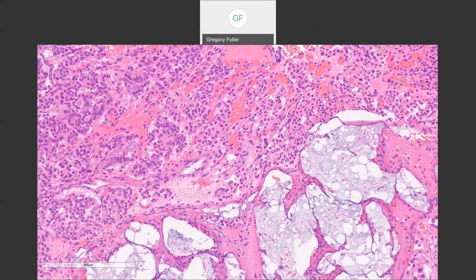Why? Are you analyzing all of the data, or are you only looking at the upper left half of the screen, which shows what looks like adenocarcinoma? All right, this area. Are you paying attention to this bottom area at all? Do you see any tumor cells in this bottom area at all? No. Did you think that this was mucin? Why is there no mucin up here? None at all, 0. So we're separating the mucin from the tumor, all right?